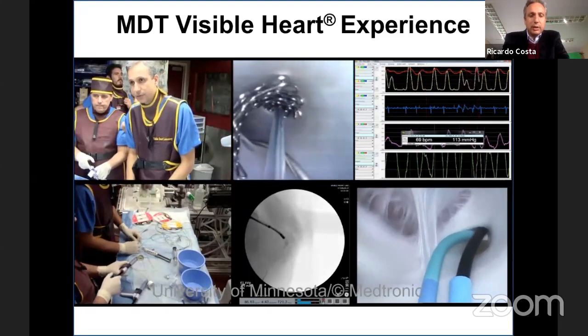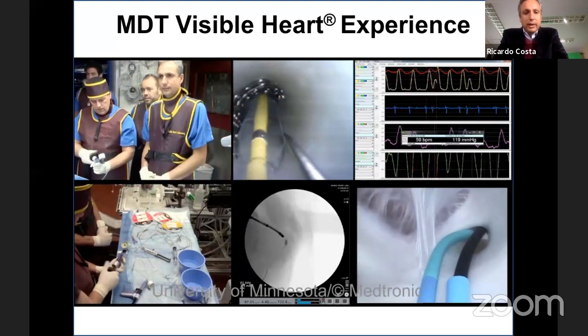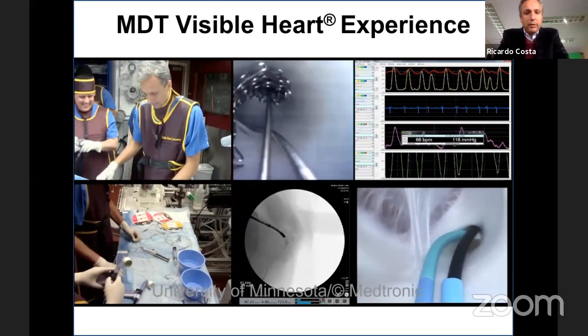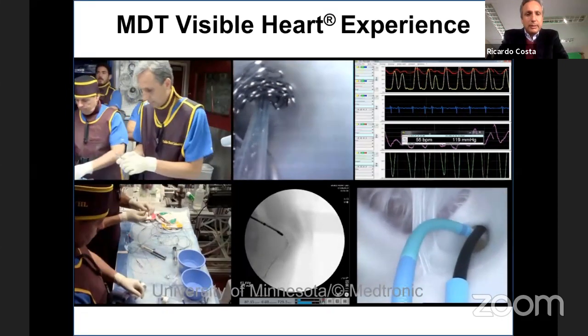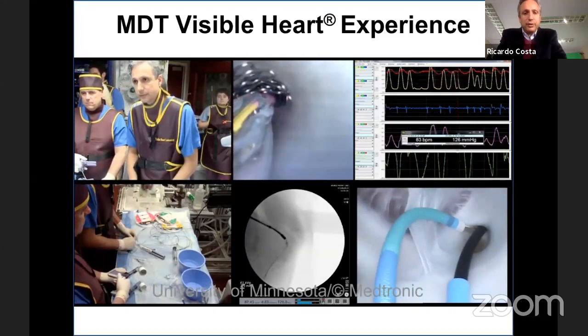At this particular point, I think going to the distal strut is better because you don't have much metal in the carina area. Here we're having an opening of the ostium on the side branch. Now we're going to have balloons in both branches, and that's when we're going to perform the first kissing balloon. So why do we do this first kissing balloon?